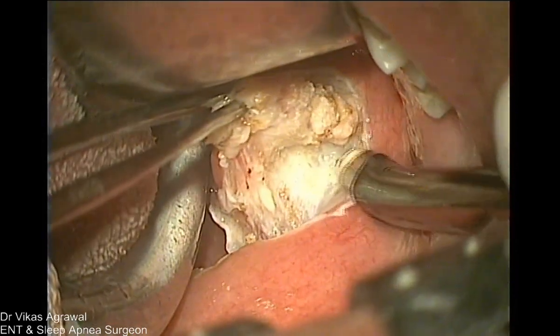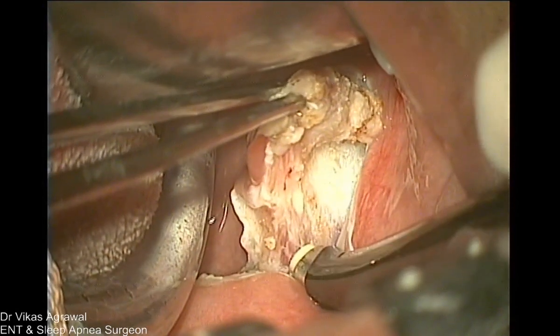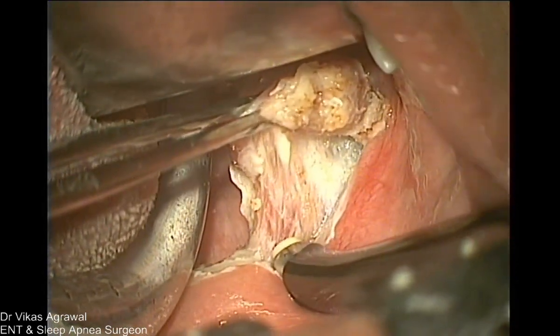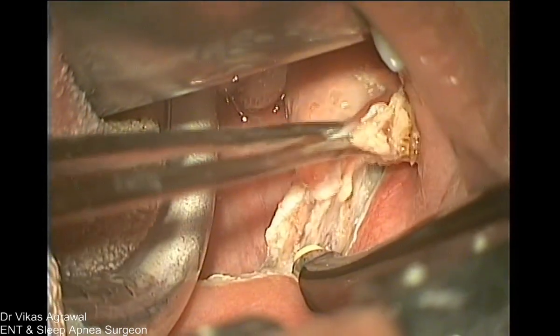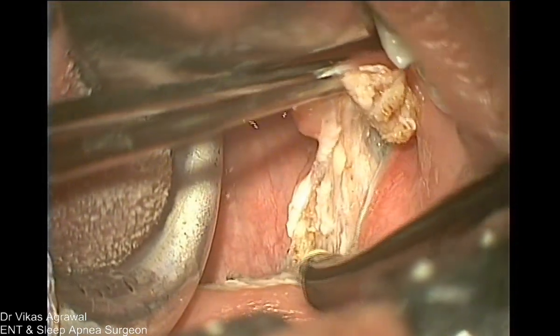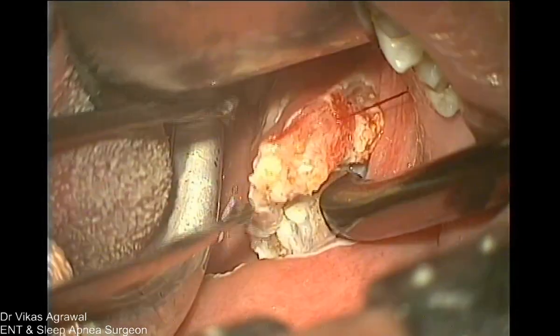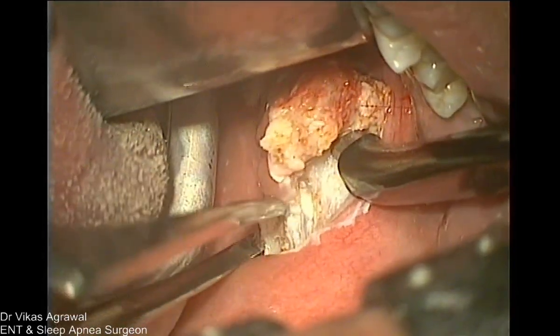Now see, this is the tonsillar fossa and this is the posterior pillar. Right. So which muscle is this, Rahul, now? The palatopharyngeus. So we have to cut this palatopharyngeus without any fear, because the job of this palatopharyngeus muscle is to pull the palate down and behind, which we do not want, right? Only thing is that you do not have to get into the lateral pharyngeal wall. So you have to know what is your limit.